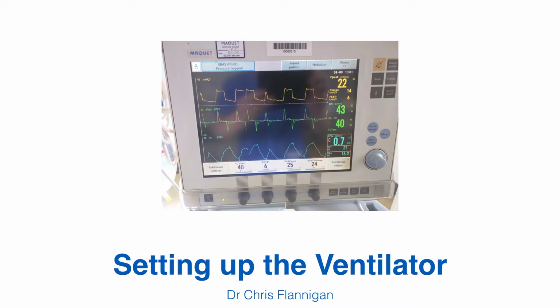So your inspiratory time tends to also increase with age. And as well as setting the time you want for inspiration, you have to set the time you want for expiration, and that's called the expiratory time. And likewise, that will increase with age as your time for the breath cycle also increases with age. So although I've mentioned both your inspiratory time and expiratory time tend to increase as your patients get older, the ratio of the inspiratory time to the expiratory time generally stays the same.